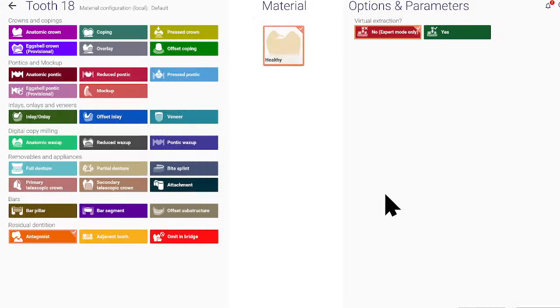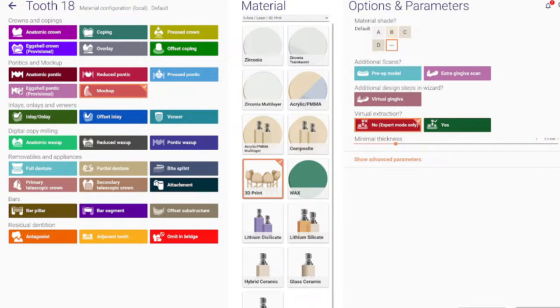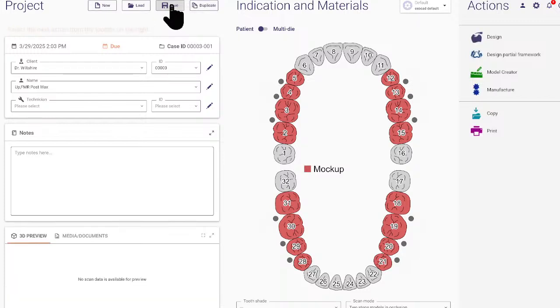Then you go over here on this patient's left, click mock-up, 3D print, OK. And then you press Shift and add the rest. Okay, so we've selected all the posterior teeth. We don't have the wisdom teeth, so we're gonna leave that blank. And at that point, you wanna save the file. So save. Okay. Now the file is saved.